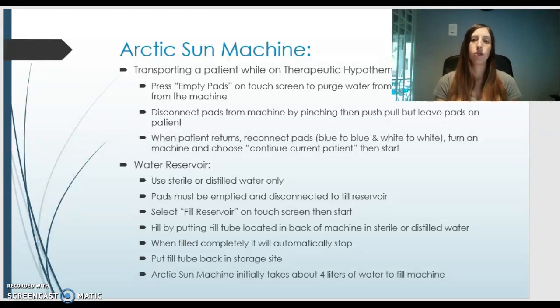A little information about the water reservoir. You want to use sterile or distilled water only. The pads must be emptied and disconnected in order to fill the reservoir. In order to fill the reservoir, you want to select Fill Reservoir on the touch screen and then Start.